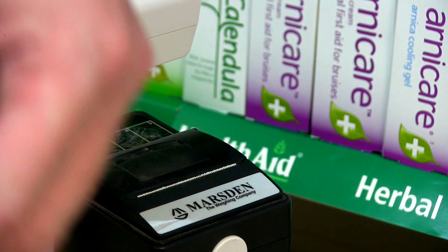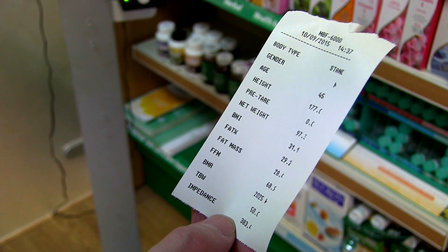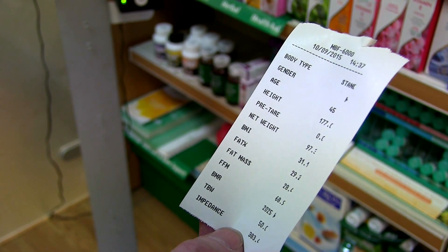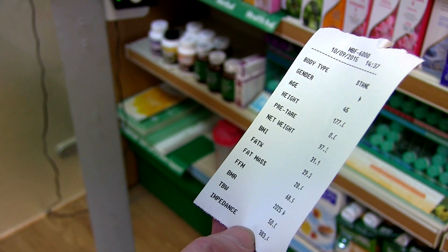The results shown are BMI, fat percentage, fat mass, fat free mass, total body water and basal metabolic rate. The Marsden MBF 6010 Body Composition Scale — tried and tested in Sussex.